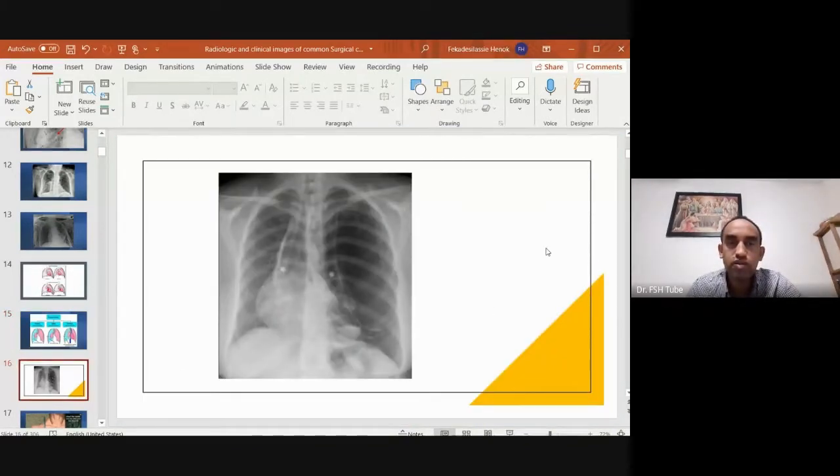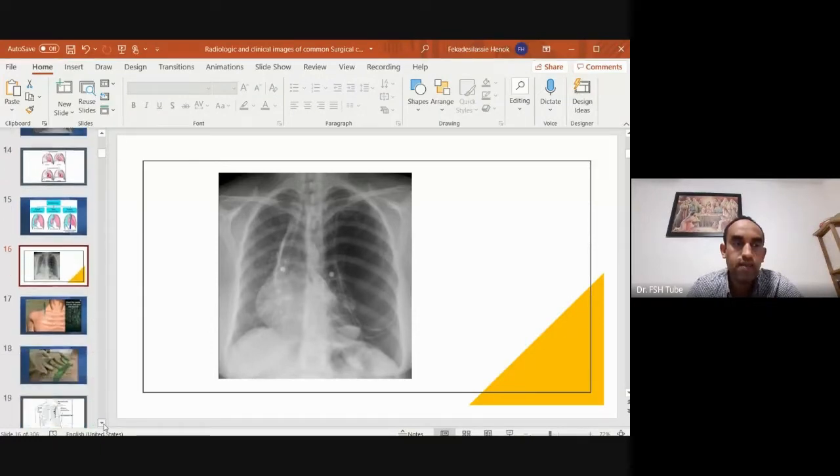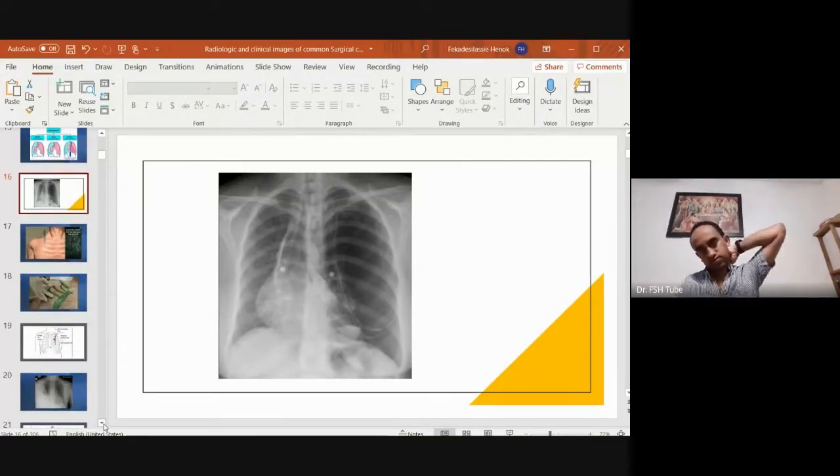What's your diagnosis here? A spot diagnosis, and we'll move on. Straightforward, clear. The heart is supposed to be in the center, a little bit inclined to the left, right? What is it doing on the right? Left tension pneumothorax. Yes, massive tension pneumothorax. Left-sided tension pneumothorax. Excellent.